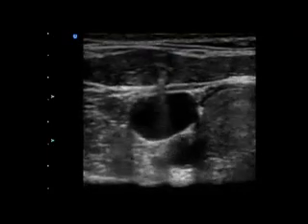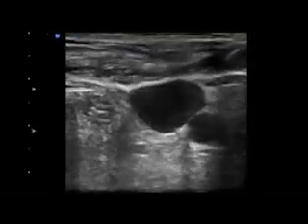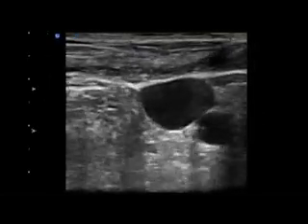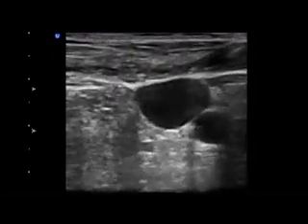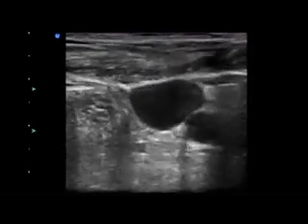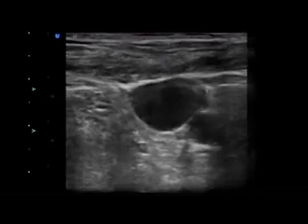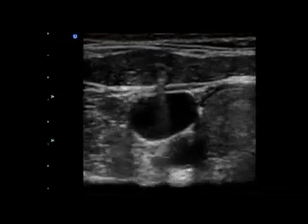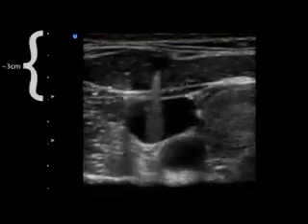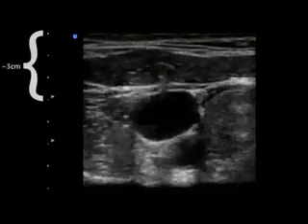The best way to determine the location of the needle is to look for movement of the soft tissue adjacent to the needle. Subtle back and forth movements such as bouncing or wiggling of the needle during insertion causes movement of the surrounding soft tissue, which is easy to appreciate on the ultrasound image. Since the exact location of the needle tip is not obvious, it is important to note the depth of the vessel on the ultrasound image and be careful not to insert the needle beyond the depth of the vessel.